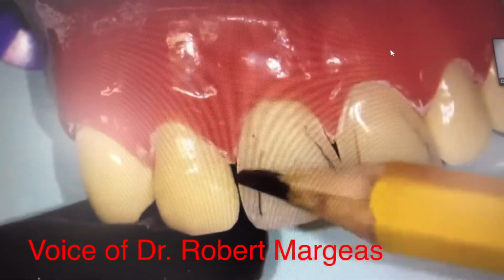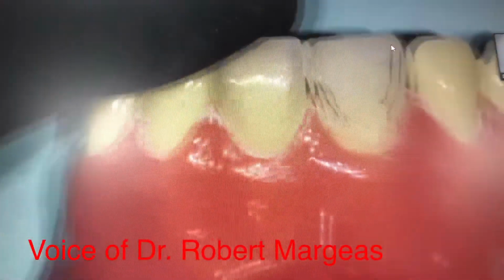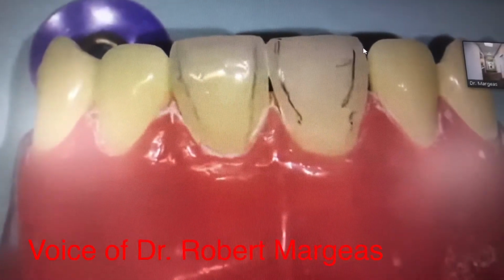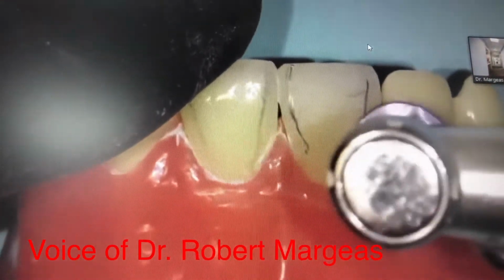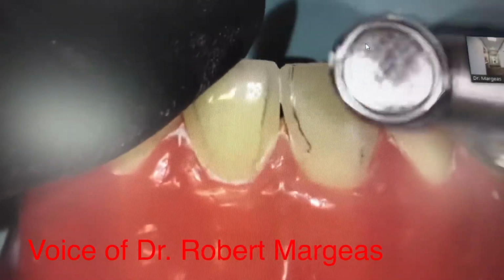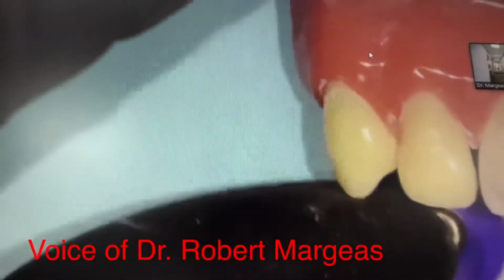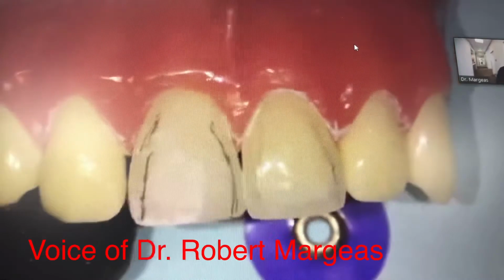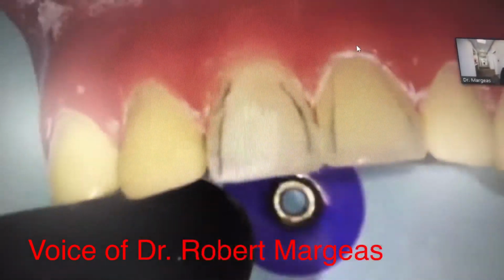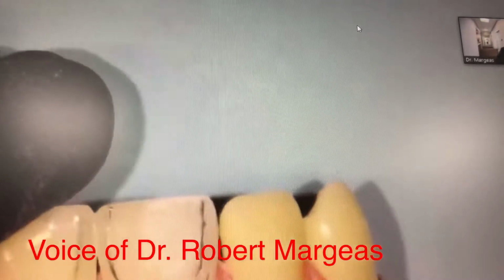And I also, on this side here, so you can see that this is too far in. That line angle is too far in compared to this one. So what I want to do is move the line angle out. So a lot of times I'll use a smaller disc. You may not have that in your kit, but I'll take a smaller disc and I'll do this. Move the line angle out and then I'll redraw it like this. Okay, I have that like that and move the line angle out. And you can see that it's still a little bit too far in. All right, and when I look at it here, it's a little bit too far in. So I want to move that out a little bit.